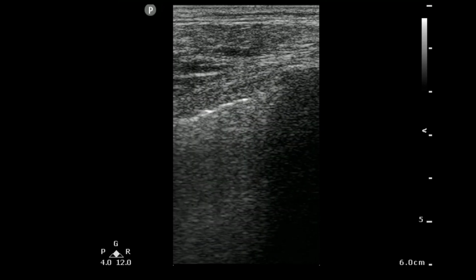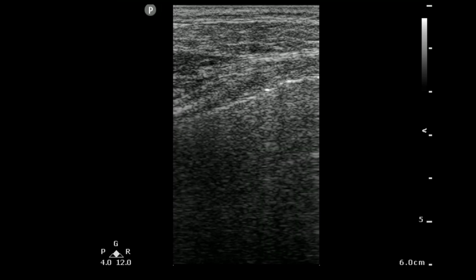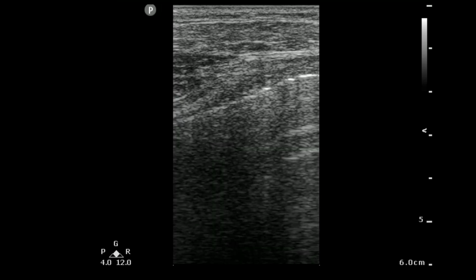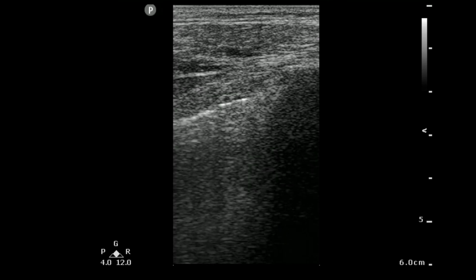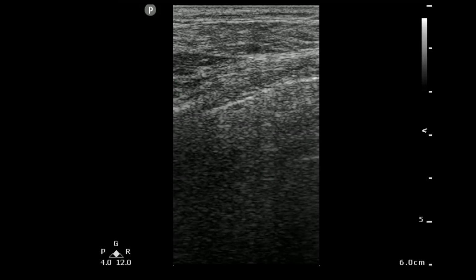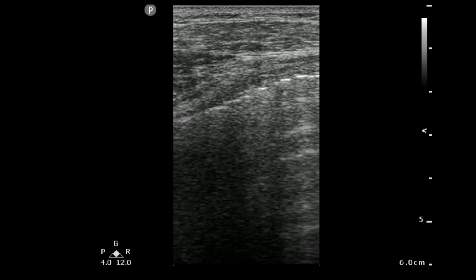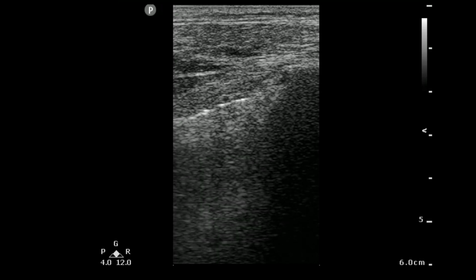If you have no lung sliding, then we're moving to different areas on the chest. Usually I go up and down the anterior lung fields, and then I come out laterally, right? So you get to the anterior axillary line, the mid-axillary line, the posterior axillary line, wherever I need to go to start finding where I have this lung point to really start defining the boundaries, how big this pneumothorax happens to be, right? This is what I'm going to do to help me find that pneumothorax.